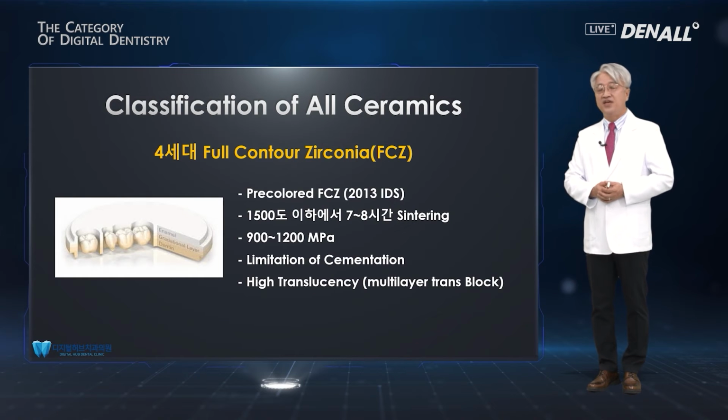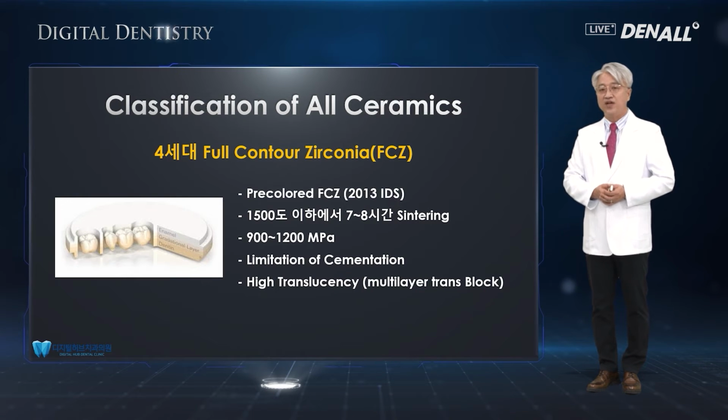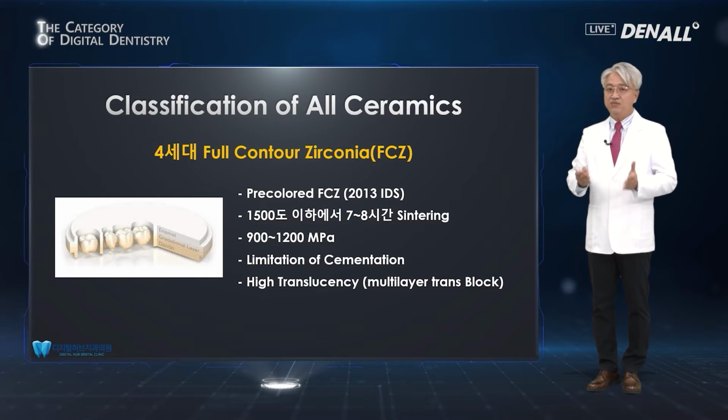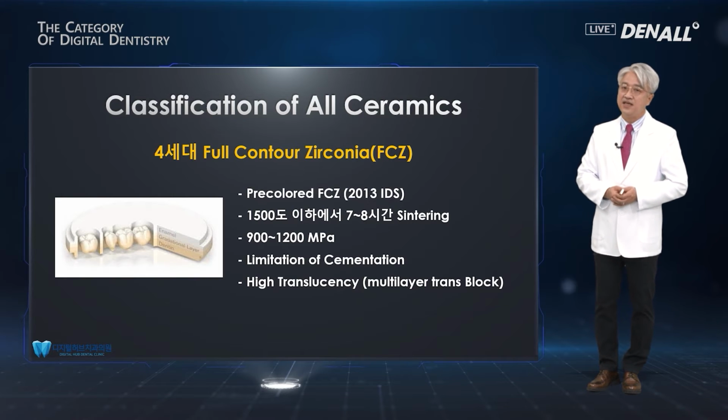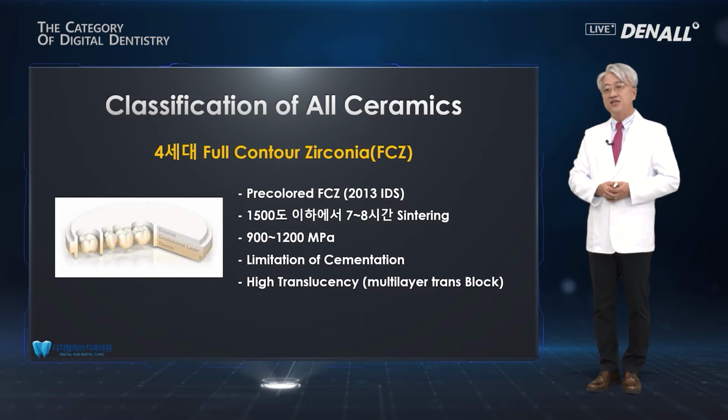Except, compared to resin or ceramics, in terms of cementation, it's not resin cemented. So compared to resin cement, now I think GI cement is mostly used. But I think overall clinically there's not much of a problem. Aesthetically, compared to the first and second generation, it was a bit lacking. It's strong, but in the anterior or aesthetic area, it only had limited use.